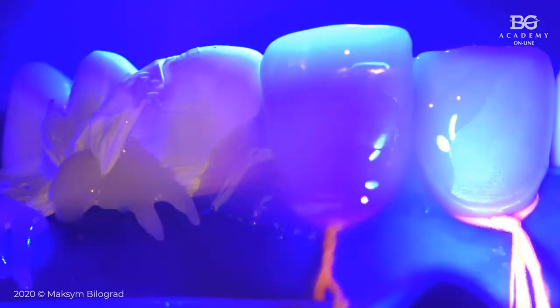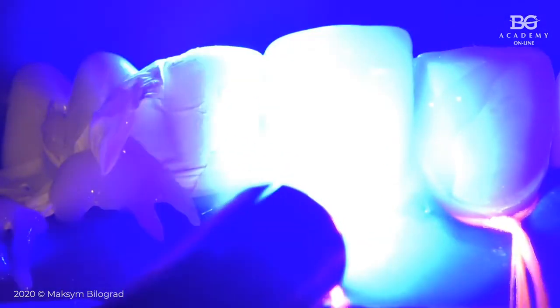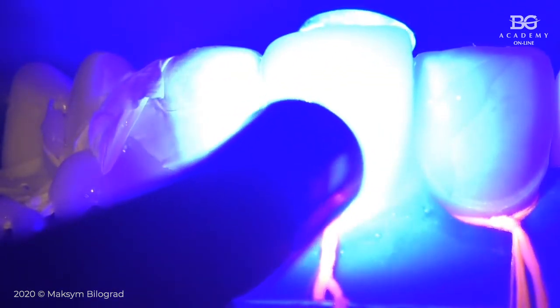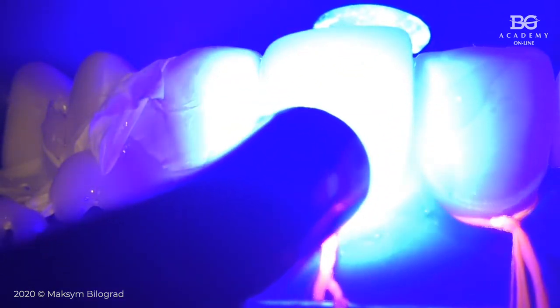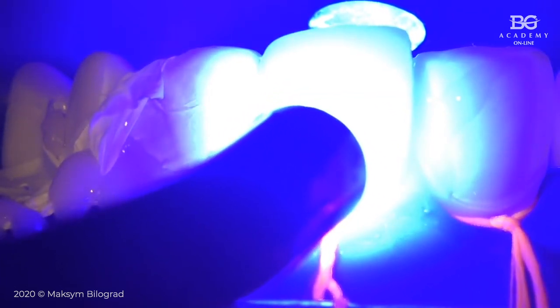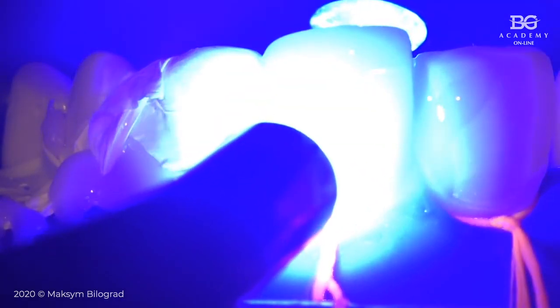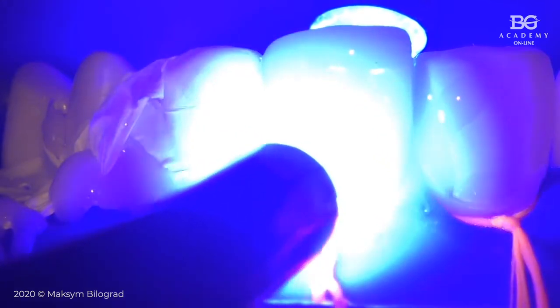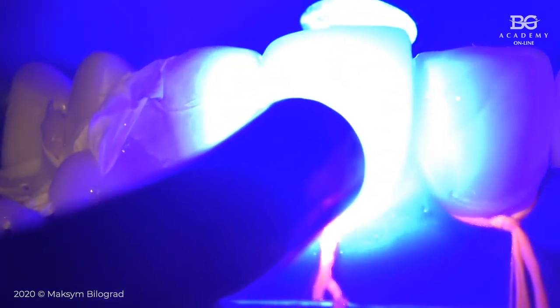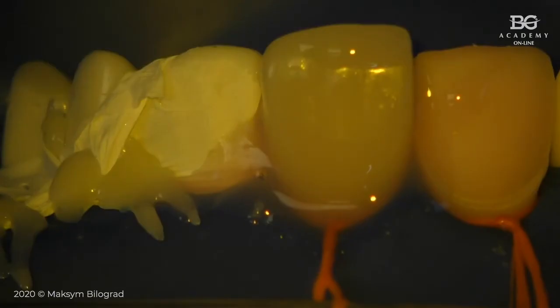So we take 2 lamps and we light cure from both sides, palatal and buccal, for 30 seconds. So this is the glycerin gel. Again, it doesn't do anything by itself. When you light cure through it, cement is light cured without oxygen, so there will be no oxygen inhibited layer. You can also remove the oxygen inhibited layer with ethanol.